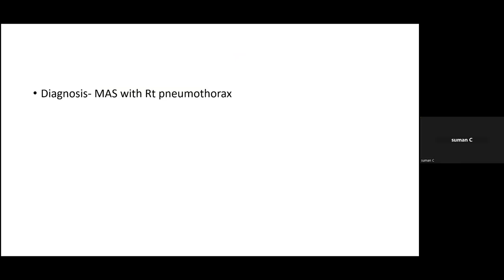Yeah. But keep practicing. I think the dictum is keep practicing. Right. Definitely got some signs. And again, we'll be talking about lung recruitment today. A very important aspect of lung ultrasound in situations like this is that a lung ultrasound done at one particular point of time is like a chest X-ray. It's telling you what the artifact with image generation is at this point of time.